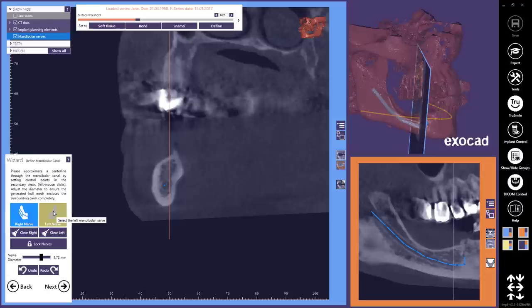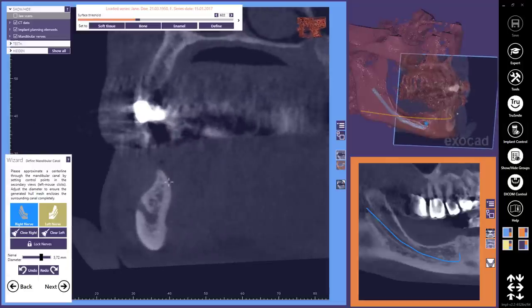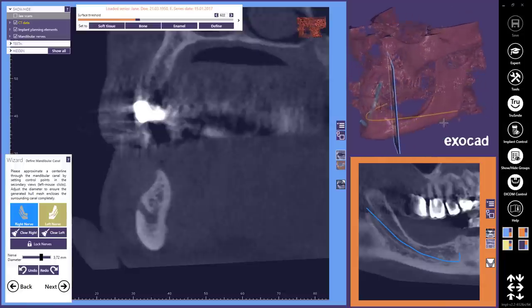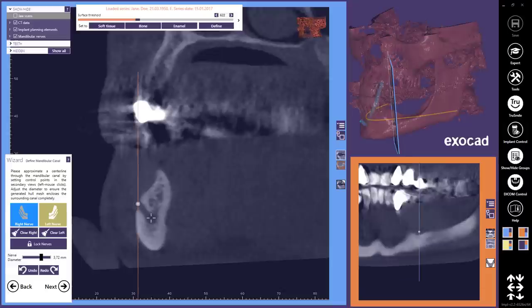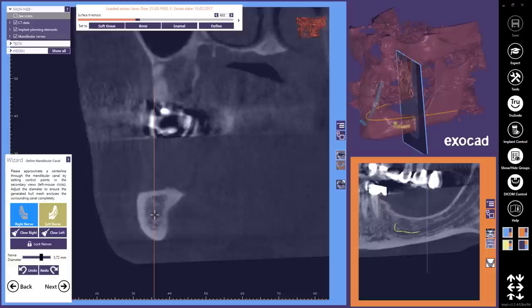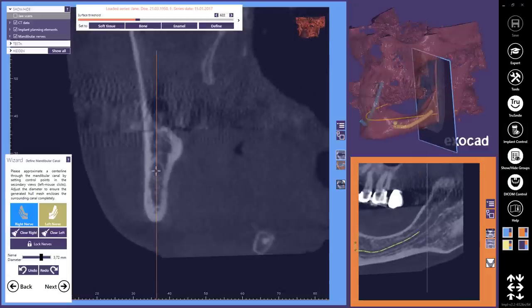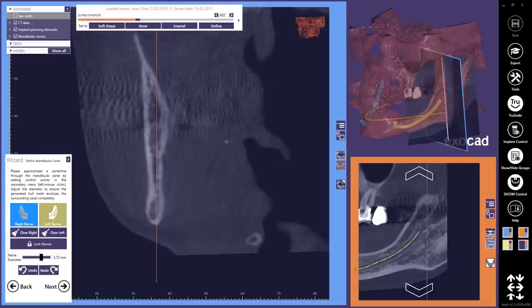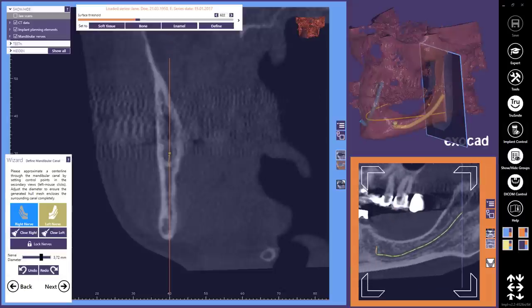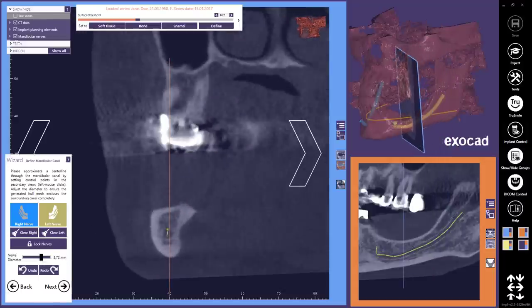For the second canal, we use a hotkey that helps us setting the control points. Activate the left nerve and adjust the curve cut view to the left mental foramen. After the first control point is set, hold the Shift key and set the second point. This moves the curve cut view automatically stepwise with a small but fixed increment dorsal along the panoramic curve. As for the right canal, we check if the adjusted diameter encloses also the left canal.